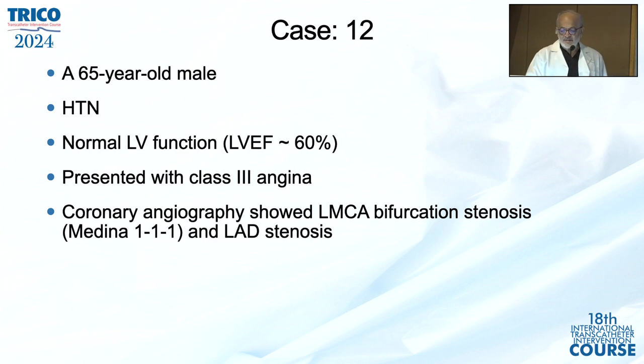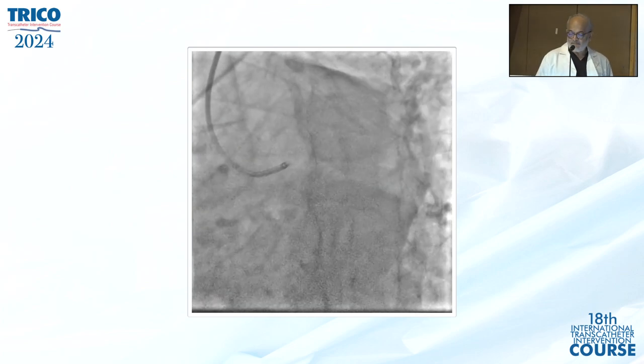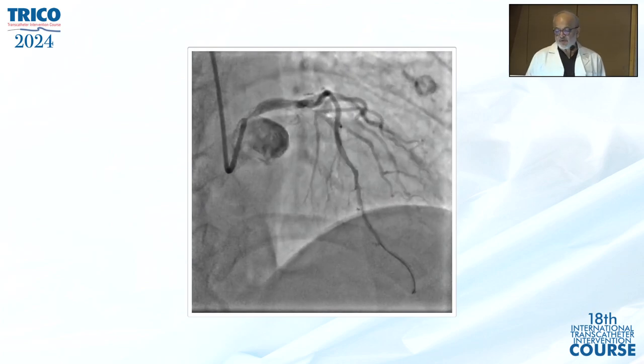This has relevance with today's one of the case, a 65-year-old male, hypertension, normal LV function, class 3 angina, presented with us with left main bifurcation Medina 1-1-1 and LAD stenosis. OCT and IVUS both were done to evaluate properly.